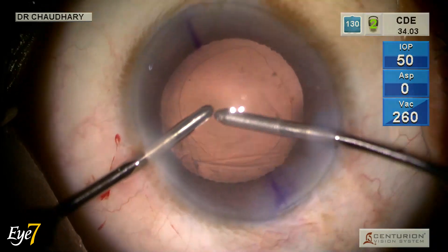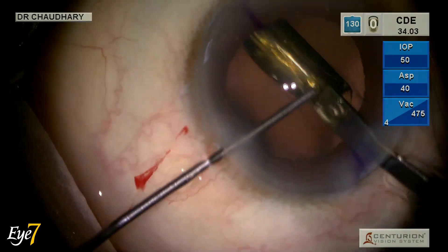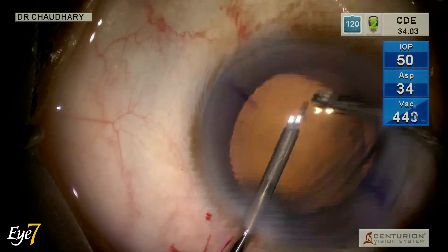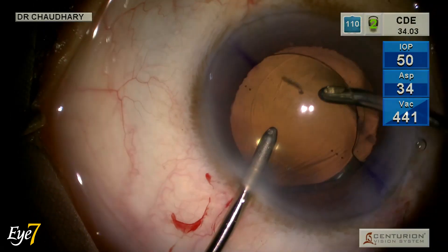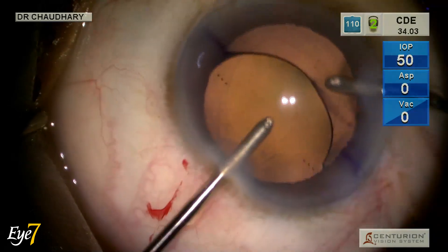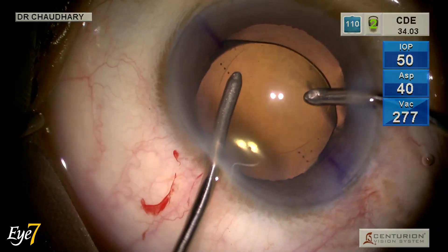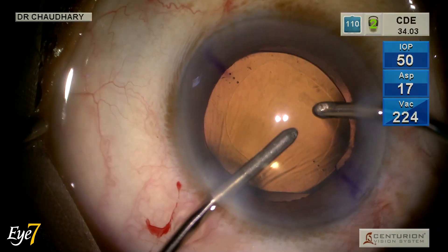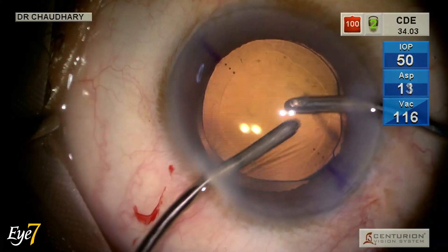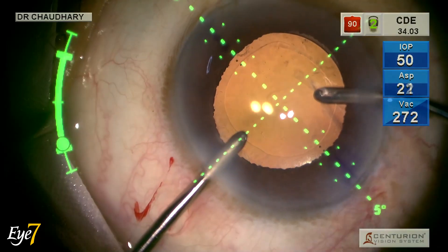The Vivity Toric IOL is implanted under hydro-insertion. We avoid viscoelastic because it has slippage properties that can affect IOL positioning in the bag. The residual visco is removed from both under and over the IOL. The axis marks are brought into position and verified with the help of the digital axis marker.